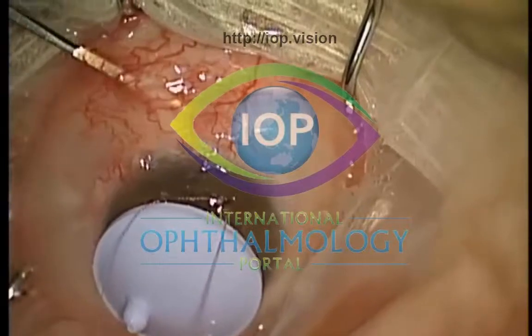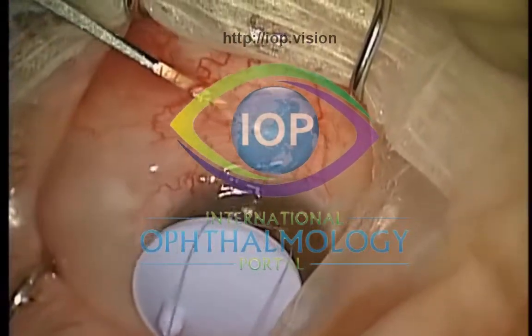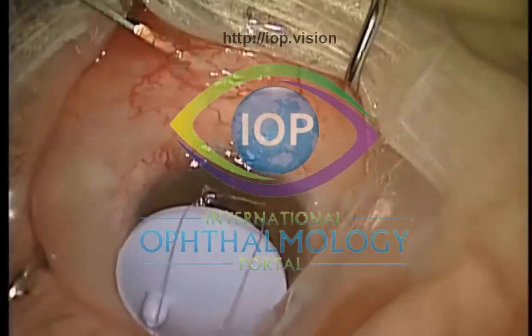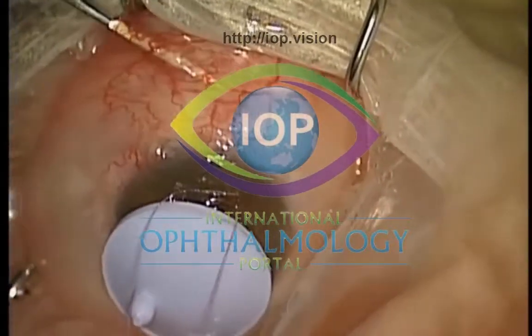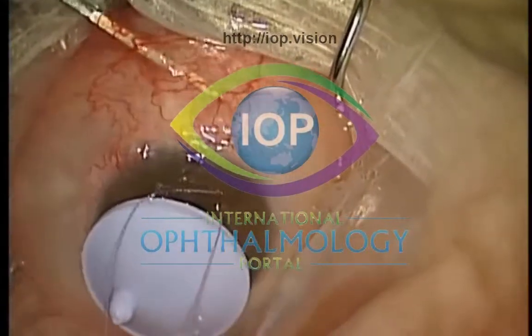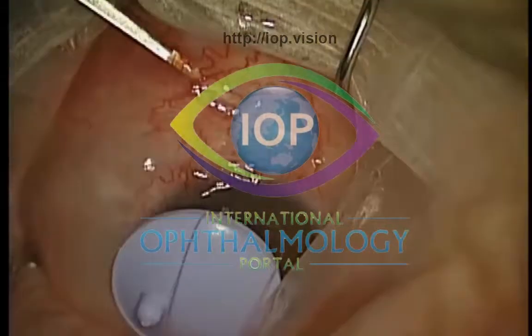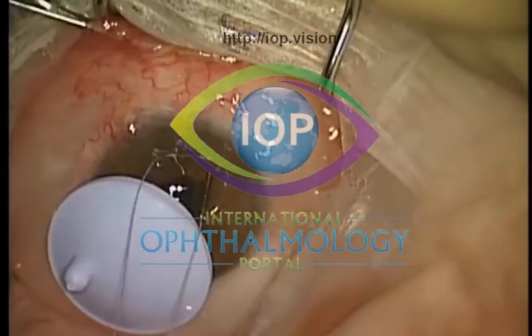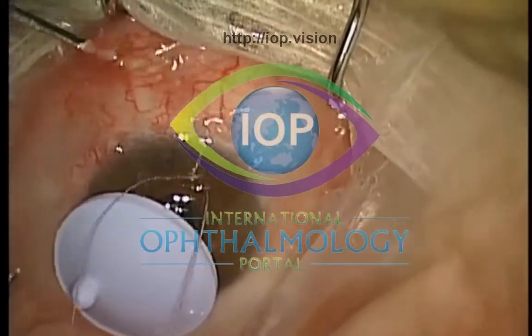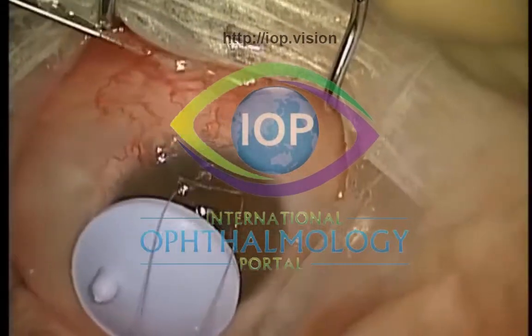Everything, really, to avoid movement. And just putting in the 5FU at the end — it's interesting, I use 5% 5FU. I notice you prefer 2.5% 5FU. Even the 5% dose generally has been safe over the years.